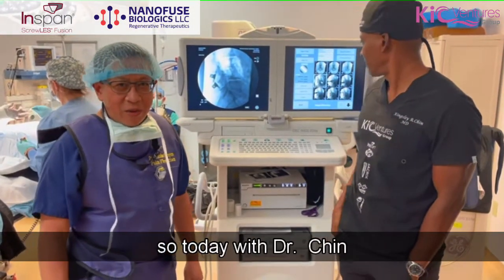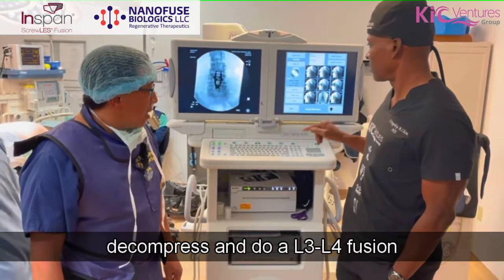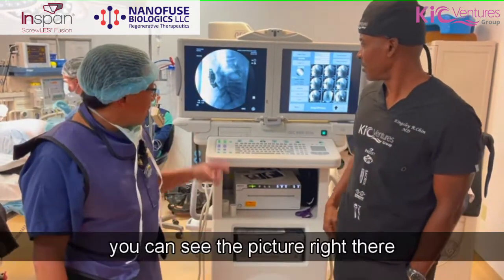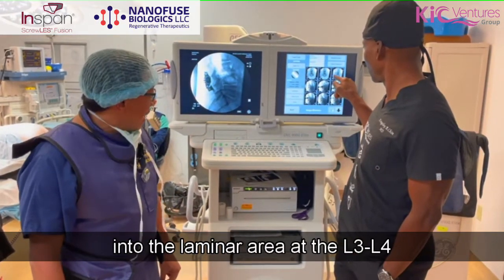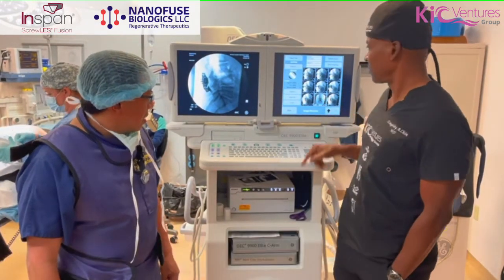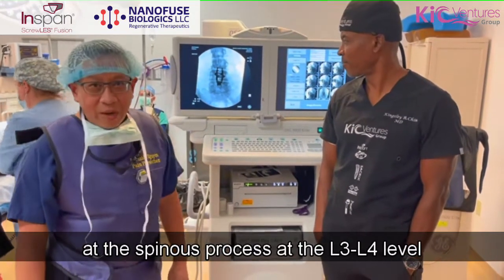Today with Dr. Chin we were able to decompress and do an L3, L4 fusion. You can see the picture right there — it shows that the device is very well seated into the laminar area at the L3, L4 level. We were also able to straighten out the previous scoliosis at the L3, L4 level.